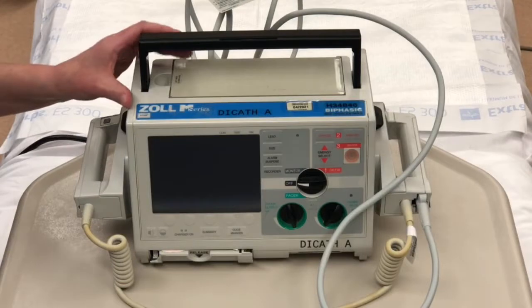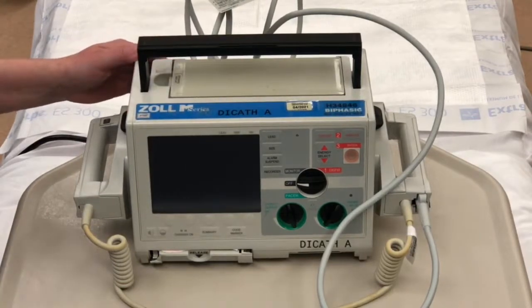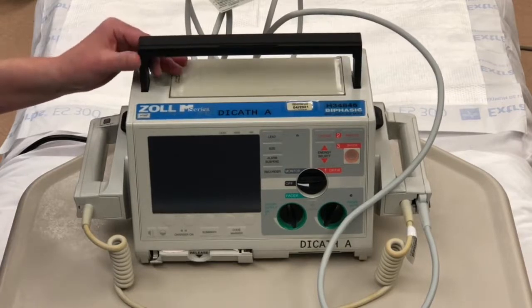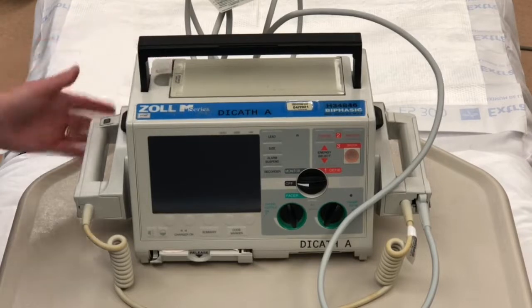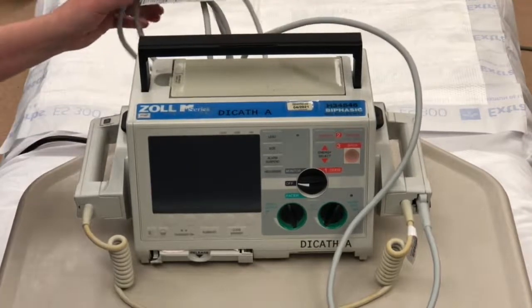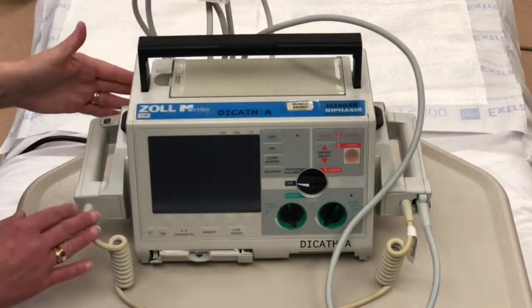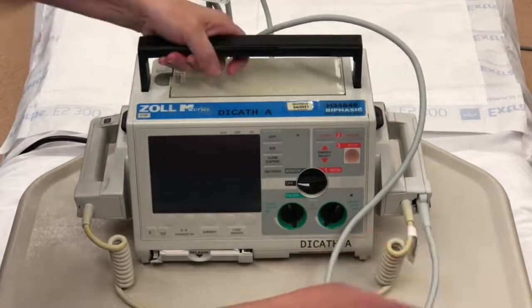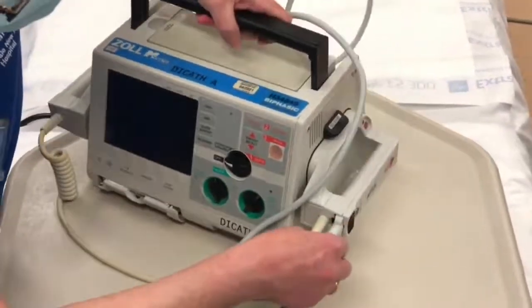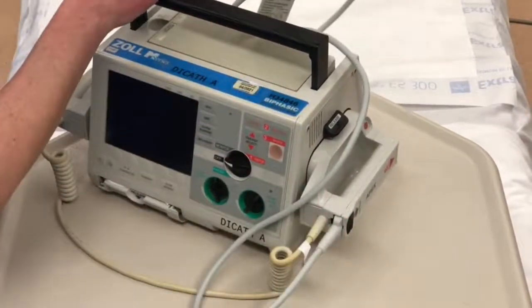So this is the Zoll M-Series biphasic manual defibrillator. This is primarily available at our York Street campus. This particular defibrillator has paddles. And going over the parts of the defibrillator, we've got a handle, our battery, paddles, and our multifunction cable, which connects to the pads and is housed either in our paddles or in the test plug.